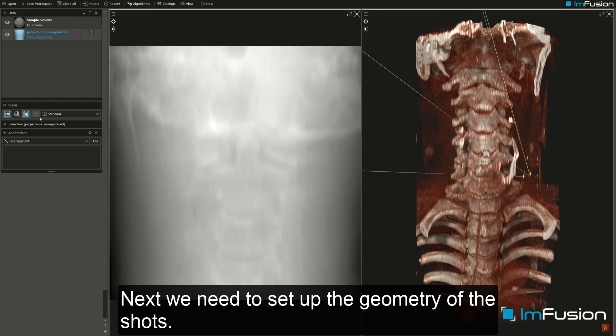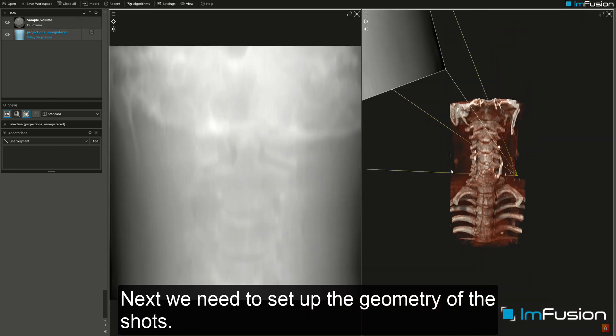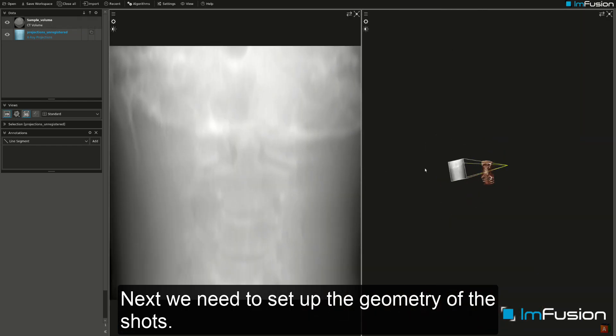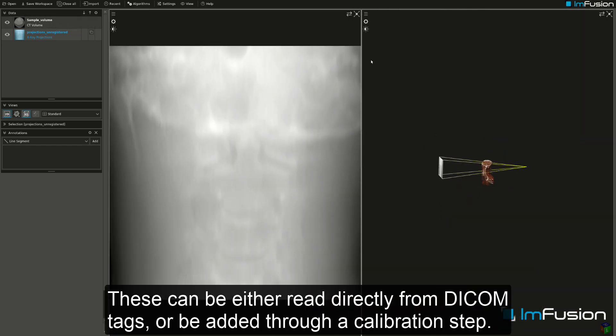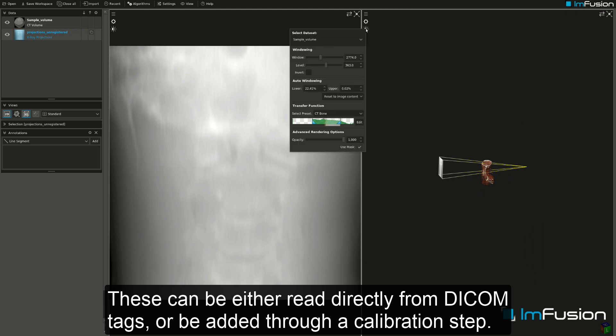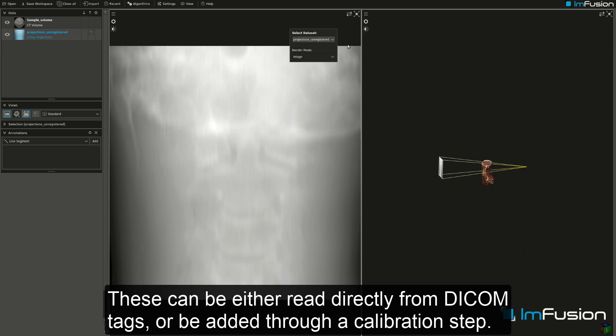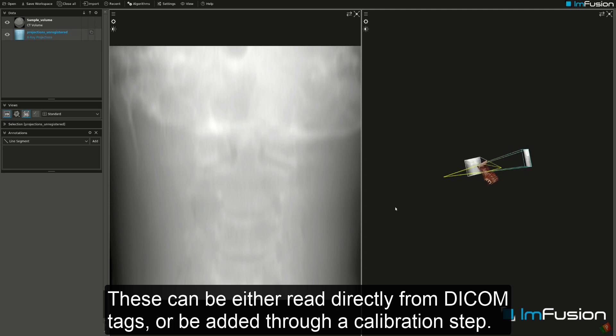Next we need to set up the geometry of the shots. These can be either read directly from DICOM tags or be added through a calibration step.